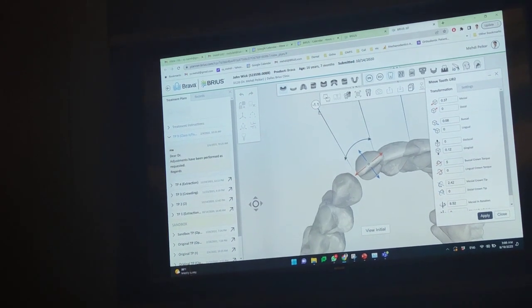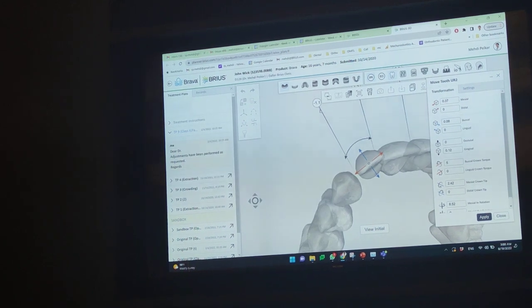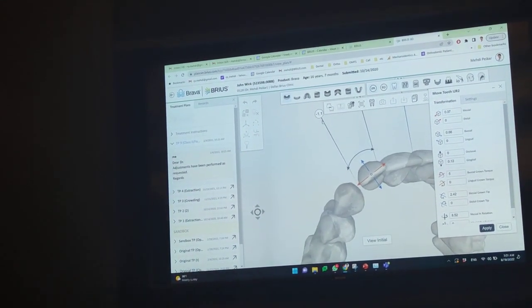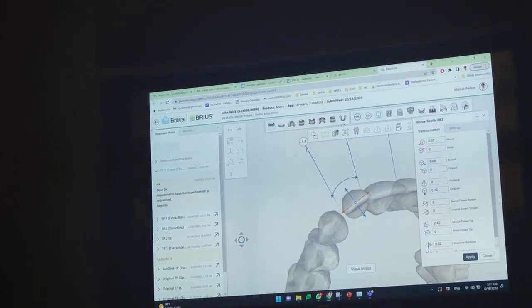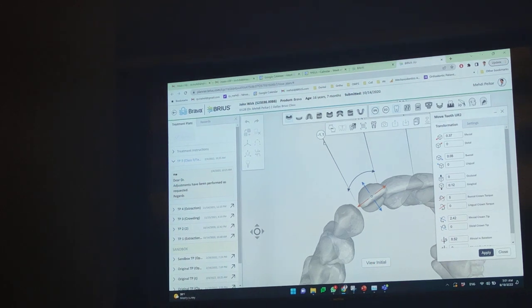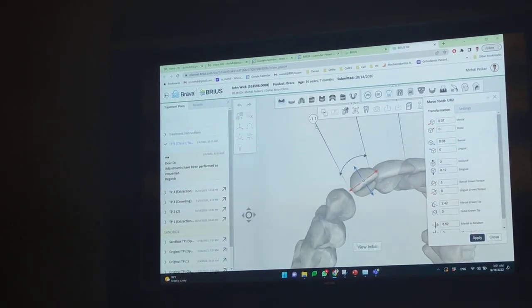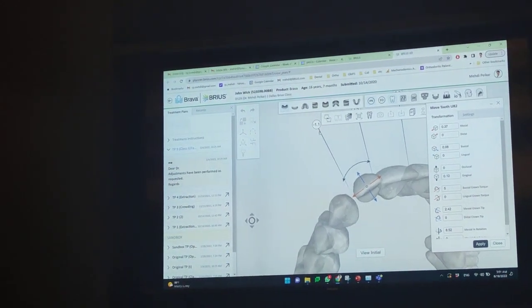With ClinCheck, when you add the space, all the teeth will move, you know what I mean? Whereas now there is an overlap. So maybe between the 1-2 and the 1-1, now there's massive IPR because it reflects that. You see? Right. Immediately in my mind I'll just write it out and send it in, and then the technician can do it, because for me to do it at multiple points like this, I think it's a lot of going round and round.